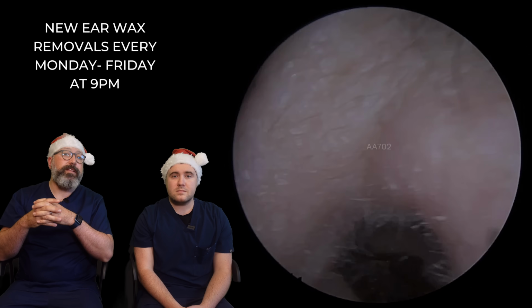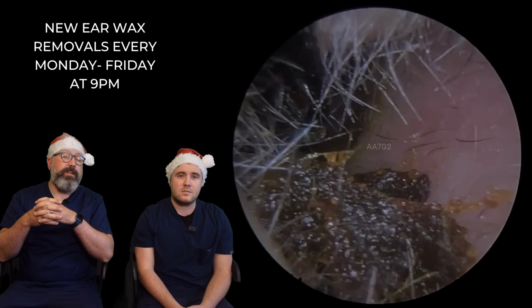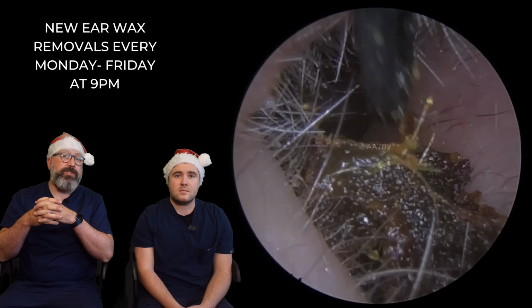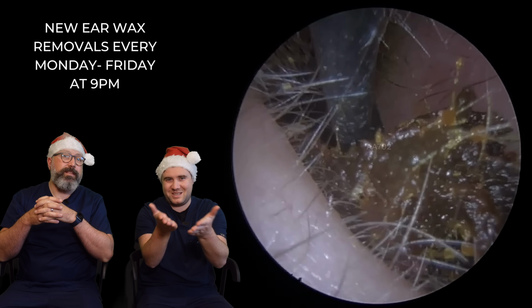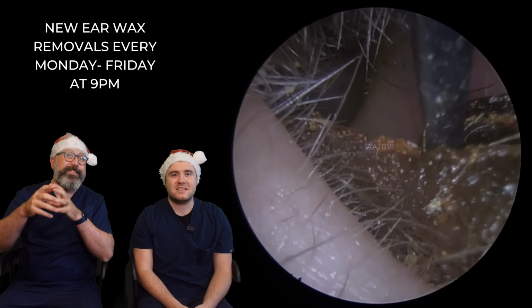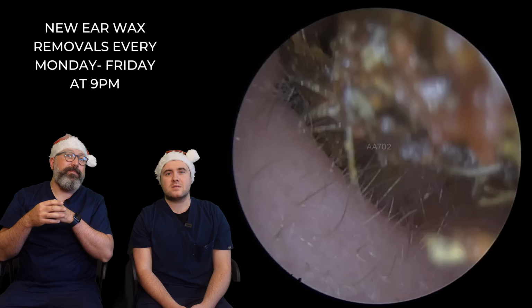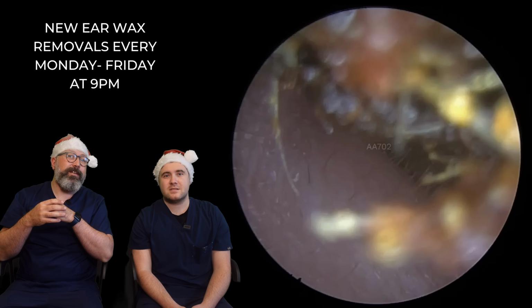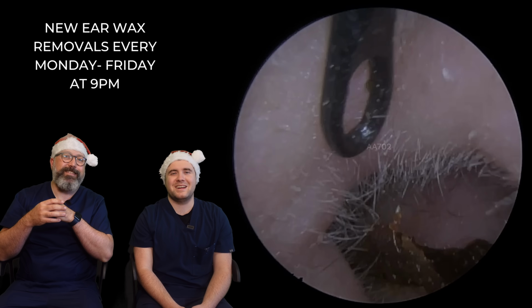So we've cleared the canal, we can see further down, we just need to get rid of the remainder of the plug here at the entrance, so we'll just scoop this around. It's almost like it's stuck. It is. It doesn't want to come away. You can see it is still stuck. You can see it just pulling away there at the back end. So lift this up. There we go. Oh, still there. Still a little bit left.